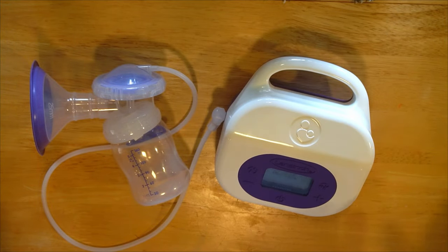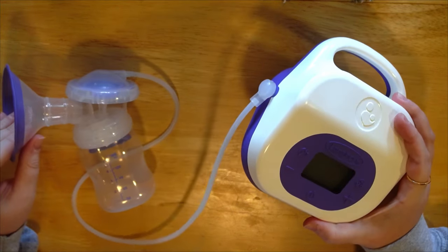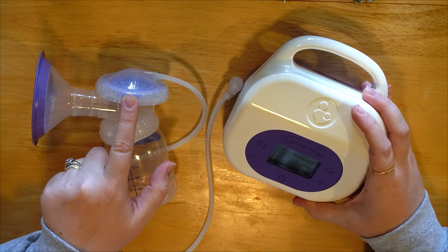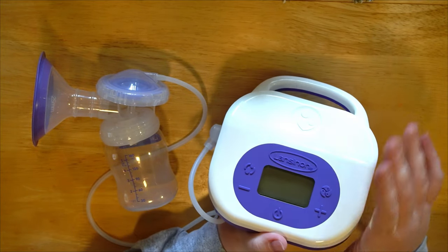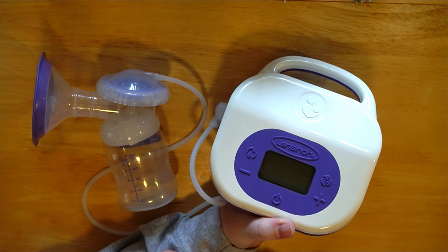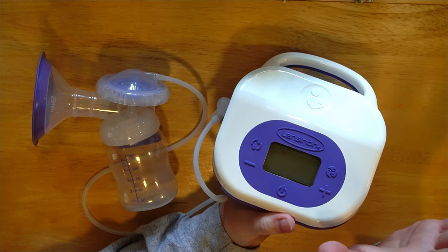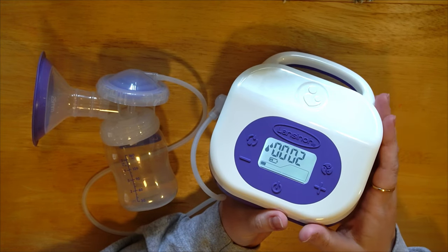Now we're going to talk about pump settings and how to get started. I have it hooked up with the tubing and the diaphragm so you can get a visual representation of frequency and suction. I'll be pausing it on and off as I talk to reduce background noise — any background noise you hear is just my kids enjoying themselves outside, completely supervised.